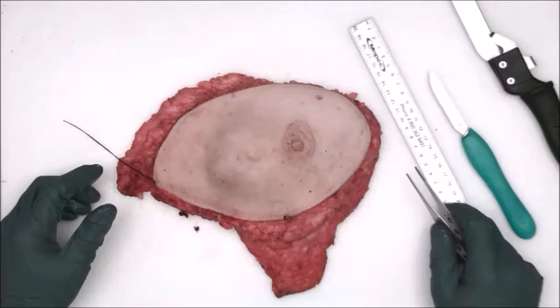And then also immediately adjacent to the areola here, in the region between the lower outer and upper outer quadrants, is a 7-centimeter area of indurated skin and a subjacent, most likely probable mass. So pay attention to those things on the skin surface, not only the nevi, but the appearance of the nipple, the areola, and if there's any skin changes. I think it's important to note.